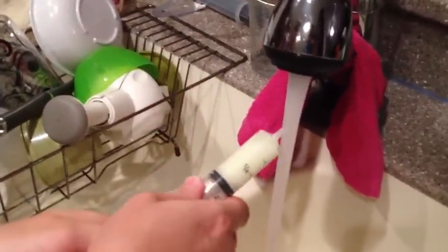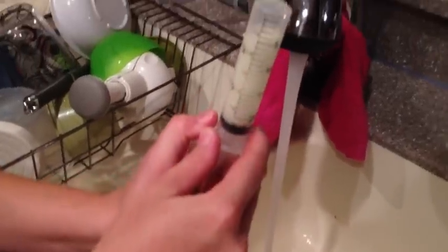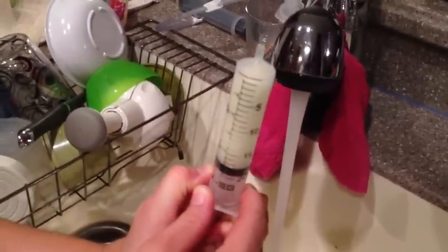Push all the air out, then repeat the process: suck more water into it, shake it up, pull back a little bit more to get the liquid out of the tip, and push the air out.